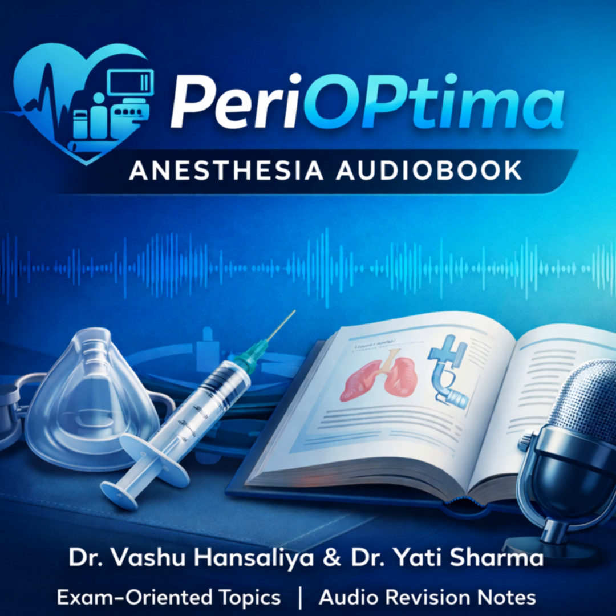Right. When you're faced with an unanticipated difficult airway, the sequence is very clear. If mask ventilation fails and tracheal intubation fails, you enter the CICO sequence: cannot intubate, cannot oxygenate. The SGAD is the mandated, crucial step for rescue oxygenation. Before a surgical airway. It is utilized prior to resorting to an invasive surgical airway, like a cricothyrotomy. Its ability to provide that 95-99% success rate in this desperate moment makes it absolutely invaluable. It is the bridge that keeps a patient alive and prevents hypoxic brain injury. So it's the mandatory pause before picking up the scalpel.